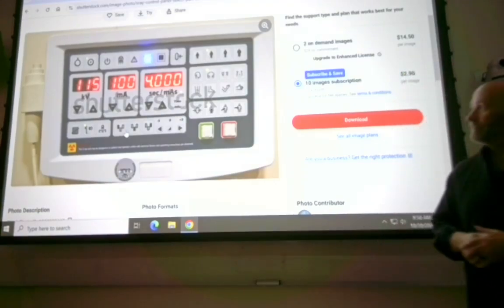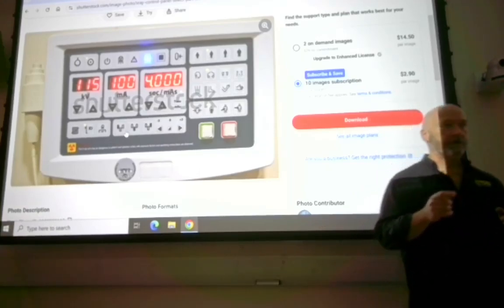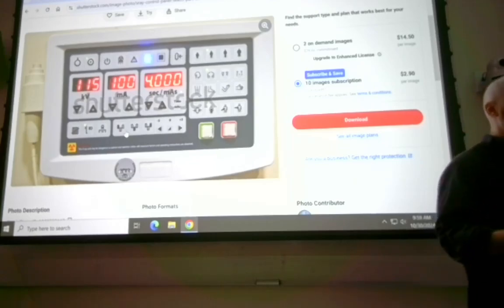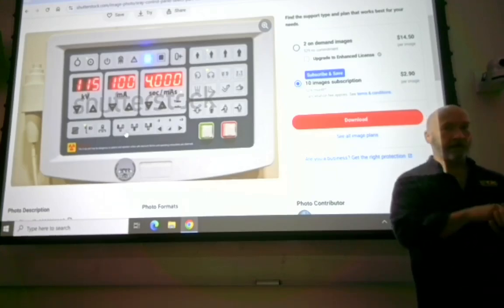So what we have then in our control of quantity, our primary control of quantity, and it's very important that you understand it's primary control, not total control, is our mAs. All right. So what is mAs? It's milliamperage. And what is amperage? It's just a count of electrons, right?